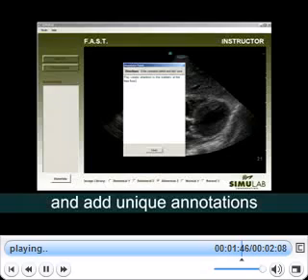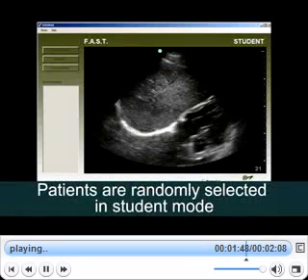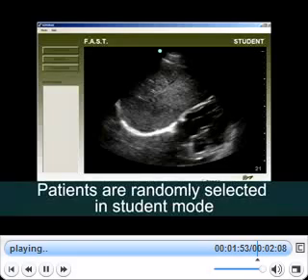In the student mode, patient images are randomly selected so that a student can be tested without knowing if the patient is normal or abnormal.